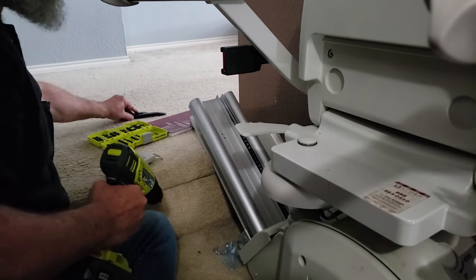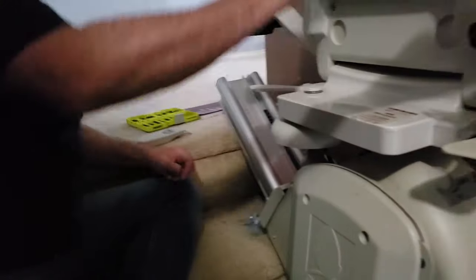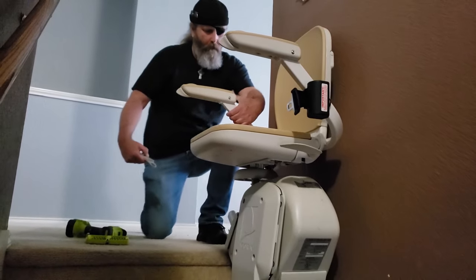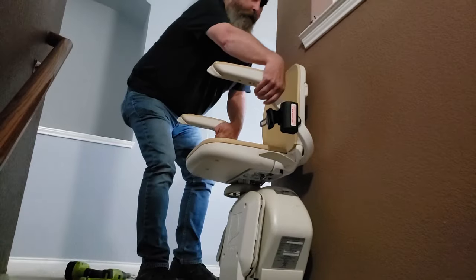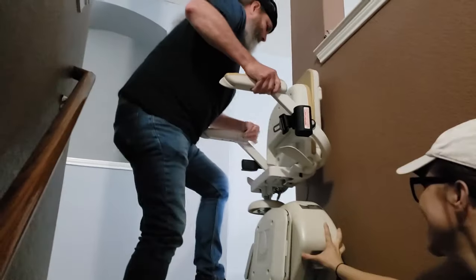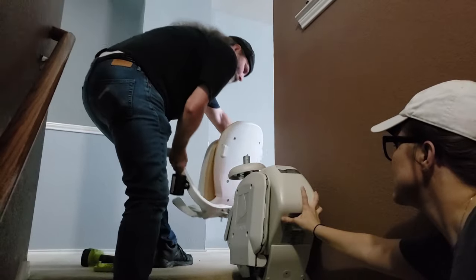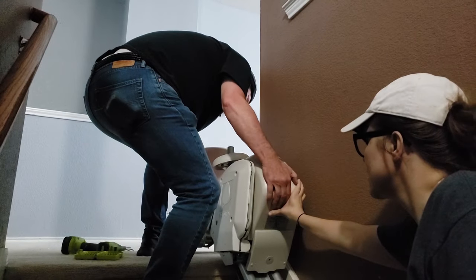Now that we've got these two things out, we're going to turn it on. And then once it disengages, take the chair off, then the unit should slide right up.